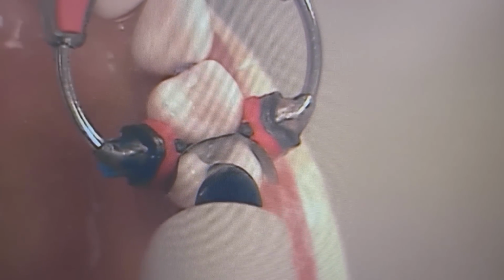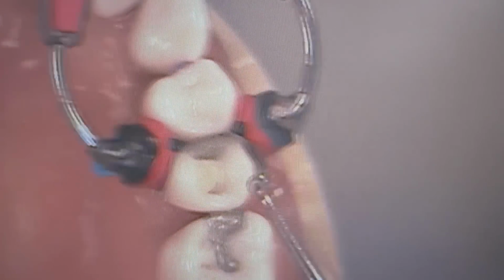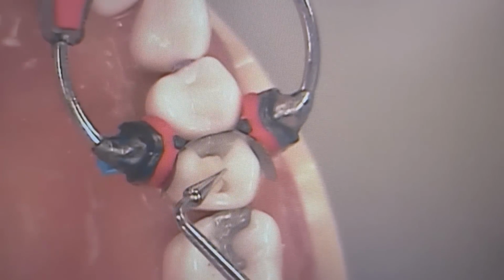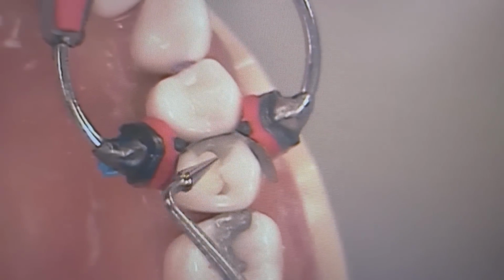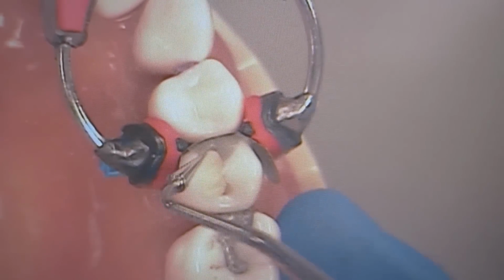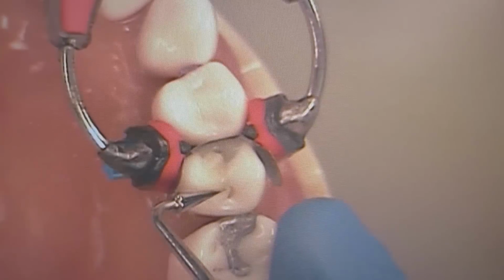Instead of rolling up into a hot dog, you can squirt the composite directly into the prep, in the hole. So now I'm continuing to press it and tap it into the preparation. Okay. Pressing it and tapping it into the preparation.